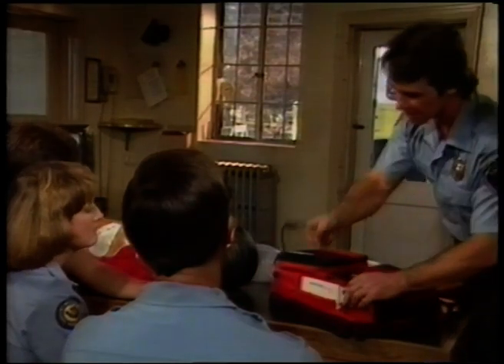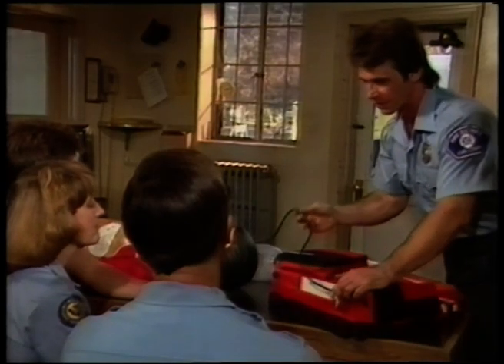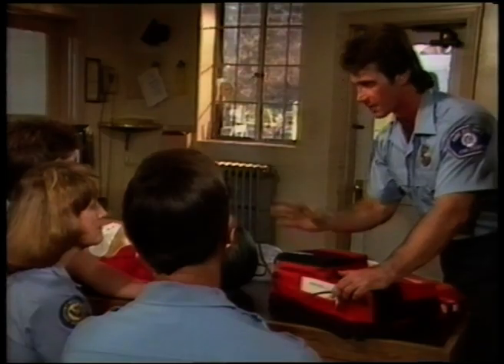The battery can be in the device while being charged. A battery charging or bat charge light located on the front panel indicates proper connection. Remember, the battery charger will not power the device. It is strictly a battery charger.